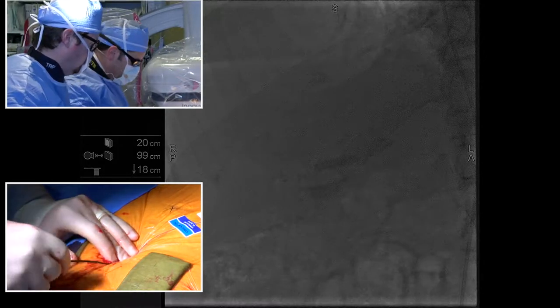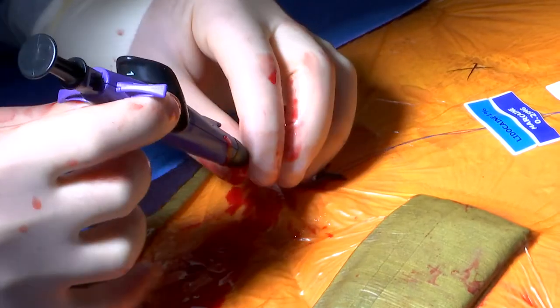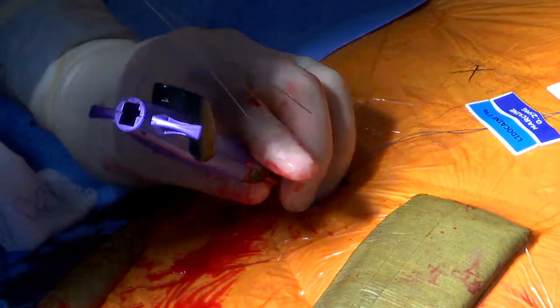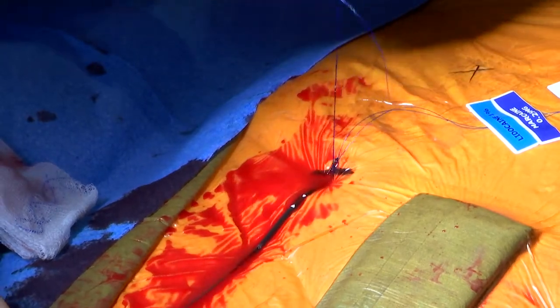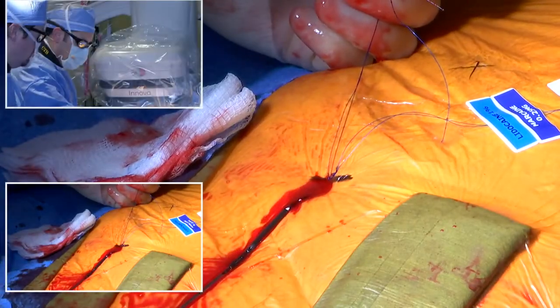All right. So this is going to go in. Okay, wire out. Good. All right. So same thing. I'm going to go in until I get flow. No flow. Flow. Rotate towards me. Open the foot plate. Pull it back. Deploy it. Cut off the handle here. And then bring the device back. Ray, can you hold that for me? And then harvest my suture and tape it out of the way or keep it organized.